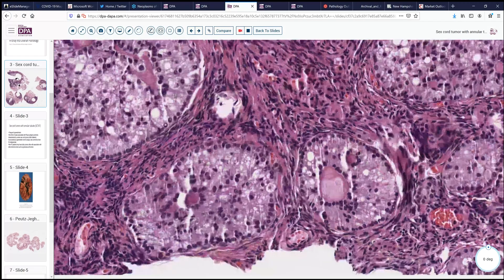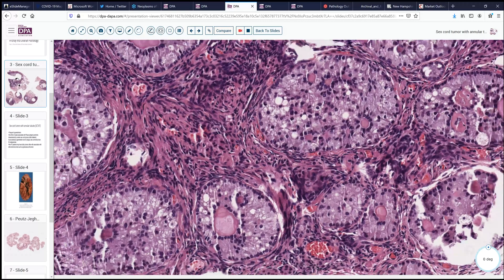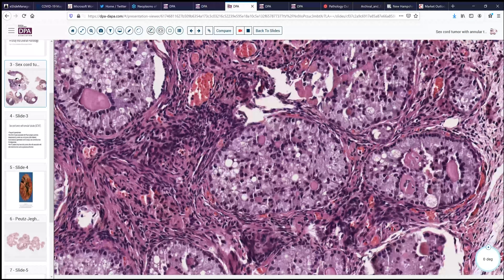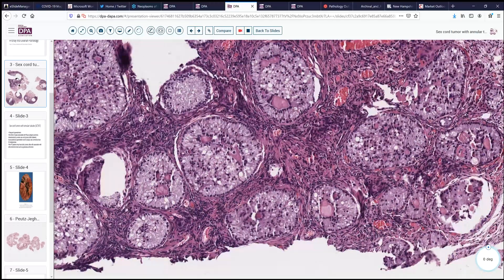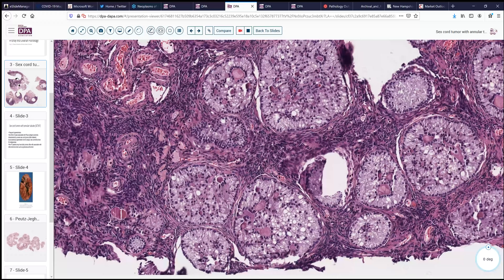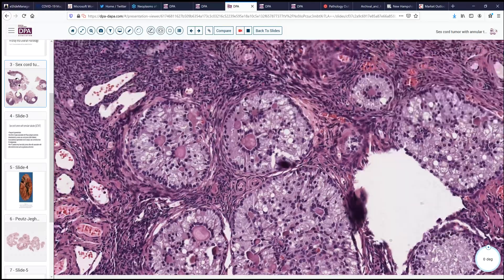So this is the pattern of a sex cord tumor with annular tubules — these hyaline eosinophilic bodies are the annular tubules. The cells are sex cord-like cells and can be mistaken for granulosa cell tumor or Sertoli cell tumors. However, the presence of these very hyaline eosinophilic bodies is diagnostic. It does need to be differentiated from granulosa cell tumor patterns with Call-Exner bodies, which it somewhat resembles, but the surrounding cells are quite different from those seen in granulosa cell tumor, so usually that is not a big problem.